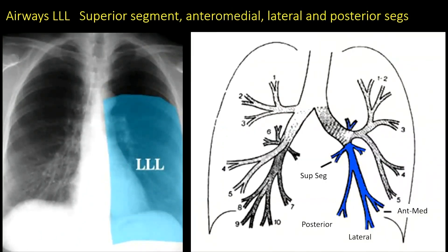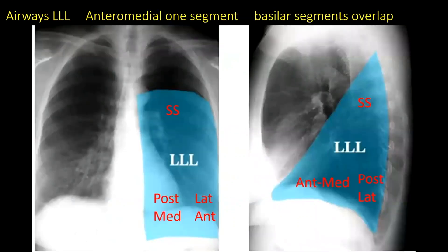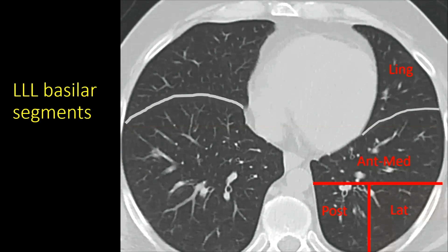The left lower lobe is different from the right lower lobe as well. There is still a superior segment. The anterior medial segment is combined — the heart is in the way, so there's not enough room to have a separate anterior and medial. There's also a posterior and lateral. On the lateral view, you can see the major fissure forming the anterior border of the left lower lobe. The superior segment is clearly identified on either PA or lateral chest, but the basilar segments overlap on both views, though you can work it out if you have both. A CT scan drawing shows the approximate location of the anterior medial segment, the posterior segment, and the lateral segment, with the major fissure separating the lower lobe from the lingular lobe.